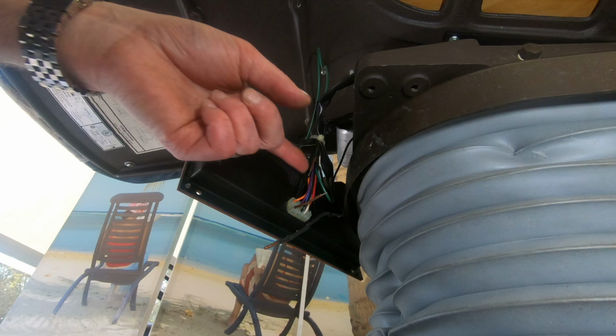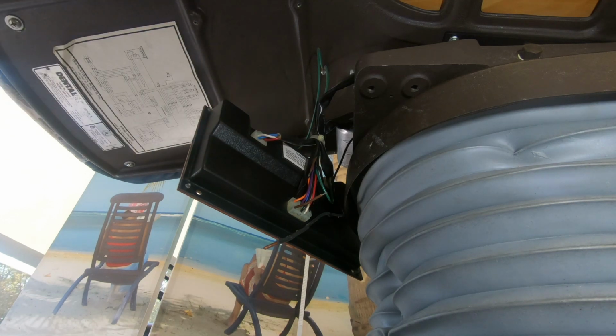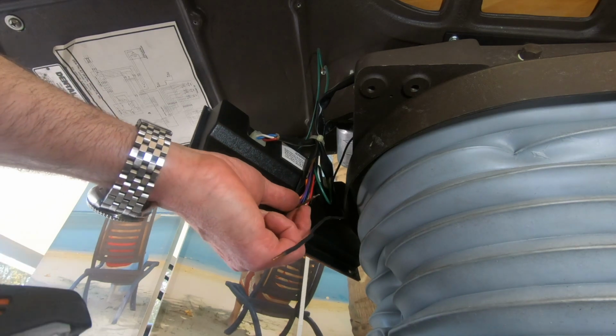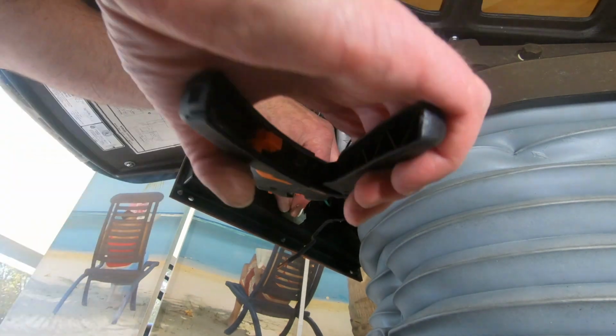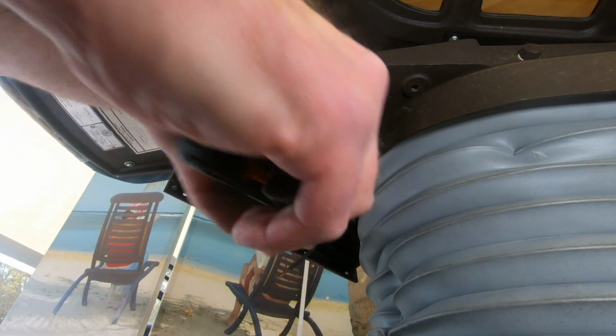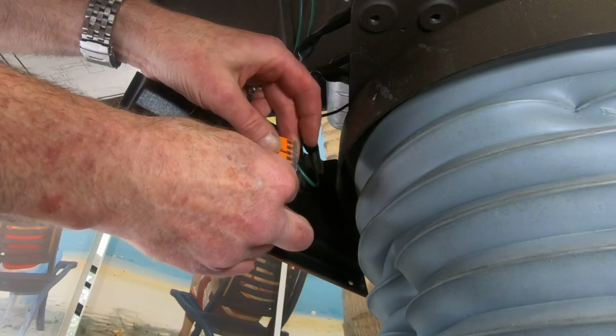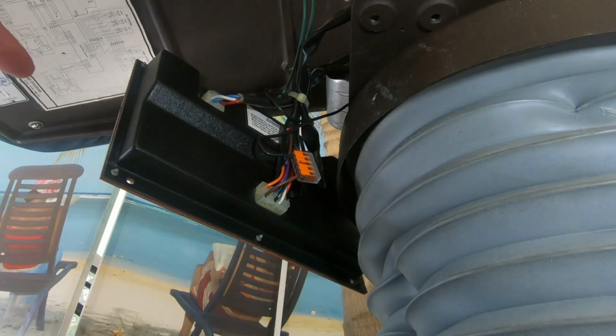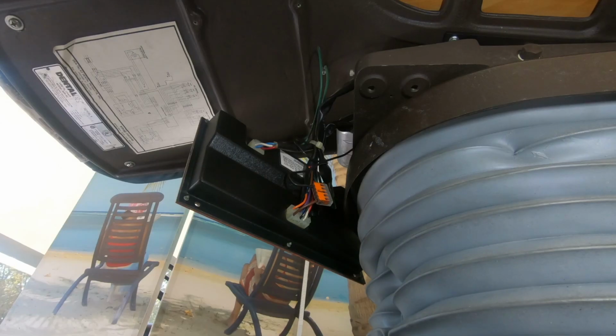Actually, I don't even need this brown connected. I just need this bottom one connected. Let's see if that works. Let's attach the other side.